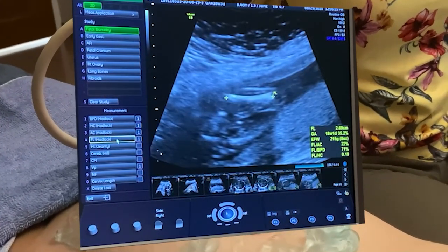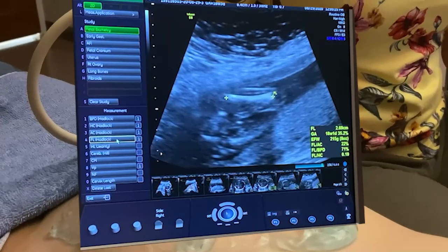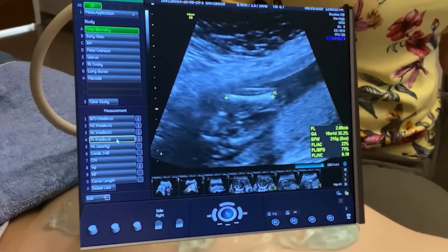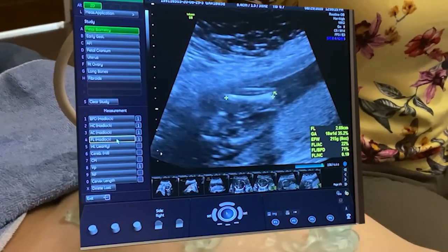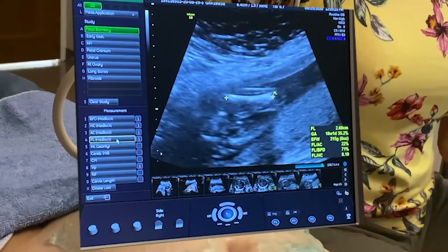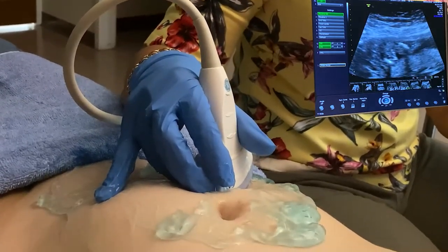And now that we've done a basic fetal biometry, it gives us the estimated fetal weight, which in this case is 215 grams or 8 ounces. The baby weighs half a can of Coke. Our average gestational age is 18 weeks, 1 day. Based on an early ultrasound, she should be 18 weeks and 3 days. And on ultrasound, we call that sonographically within normal limits.